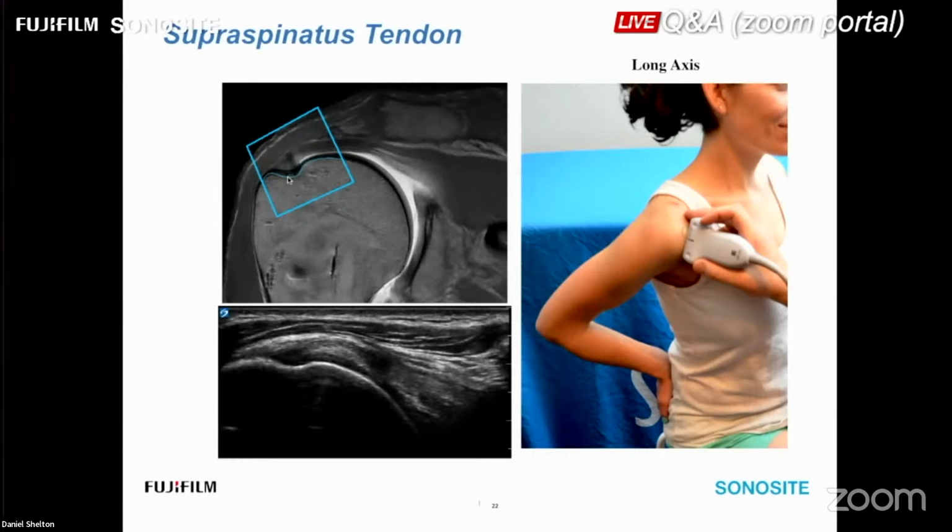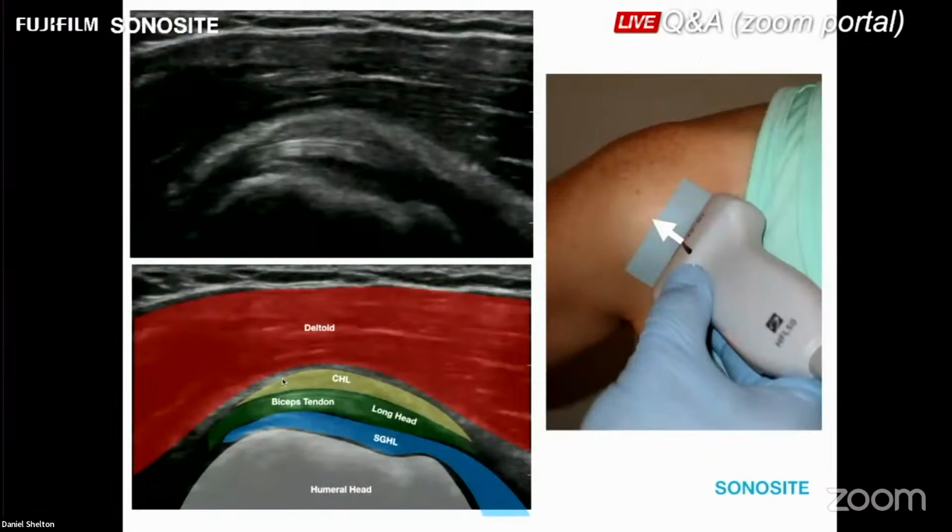But it also identifies the actual footprint of the predominant supraspinatus. Here's some angle artifact. We would tilt the probe and get that feathered out. It's anisotropic artifact, and I think if we just aim the beam back into the footprint, you'd see that clear right up. Let's go into how to scan that.